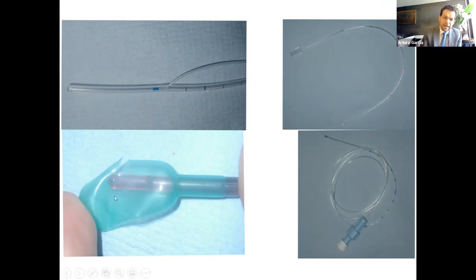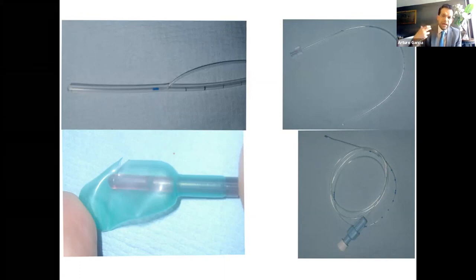This is the rectal catheter. And as you can see here, we always do a small cut in the balloon at the end of the catheter. Most of the catheters we have now in the market come with this small cut already done. But if yours don't have this slit cut, always do it before inserting the catheter. Remember, the balloon is mainly designed to stop feces from blocking the catheter. If you don't do this small cut and you start purging and putting water into the rectal catheter, at the end, you end up measuring the pressure inside the balloon, not inside the rectum.